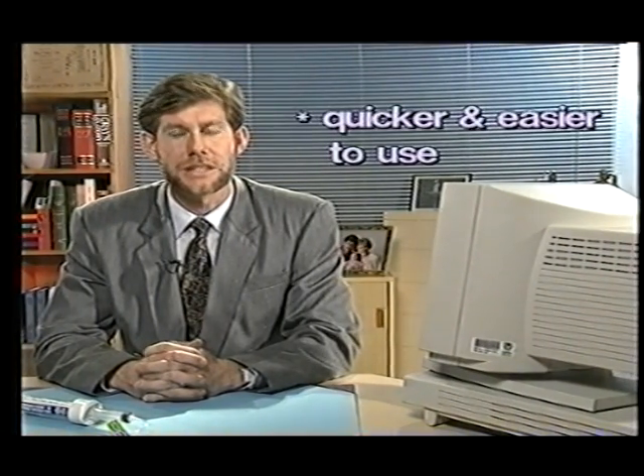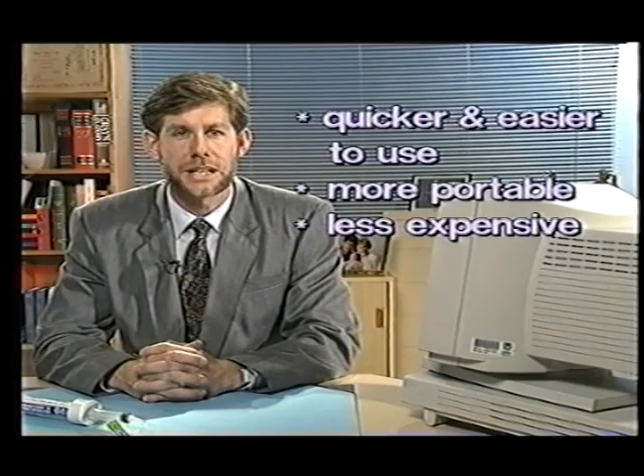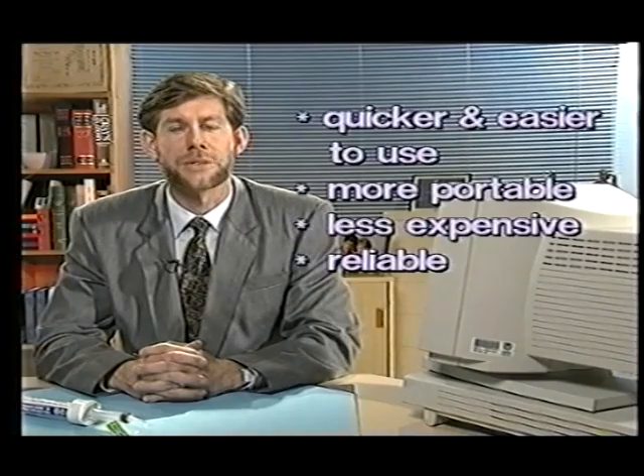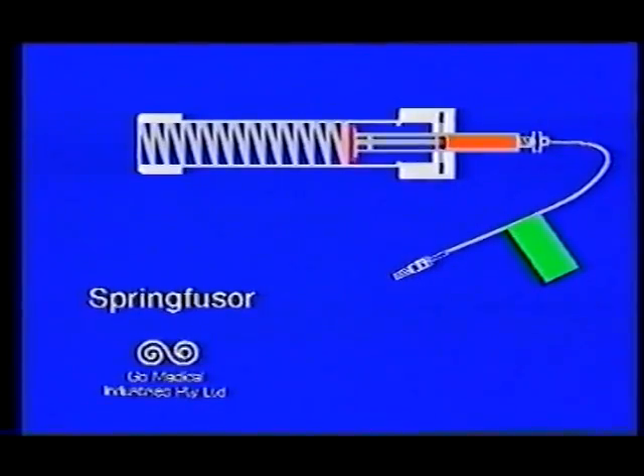Its innovative design gives the Spring Fuser a number of distinct advantages over conventional systems, making it quicker and easier to use, more portable, less expensive than other systems, reliable, and it requires no external power source. The Spring Fuser differs from other syringe pumps as it works by controlling the outflow of pressurised fluid rather than by pushing the syringe at a controlled speed.